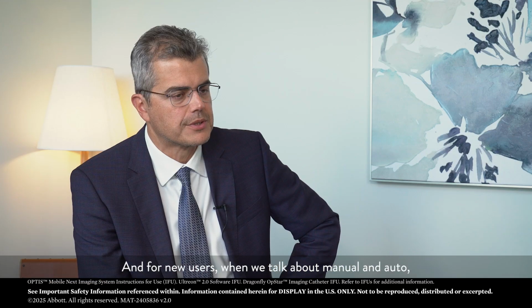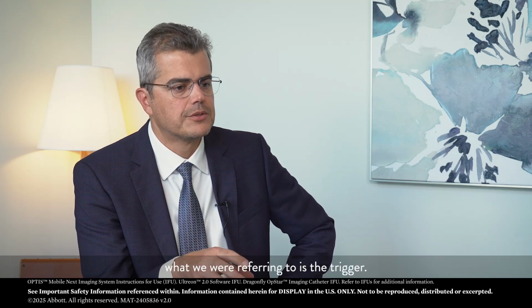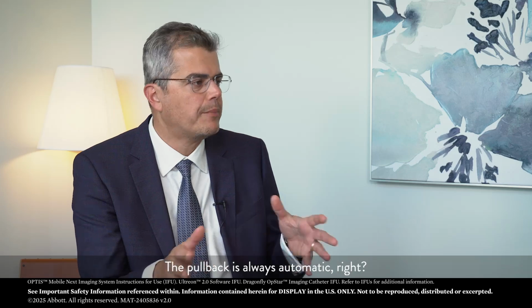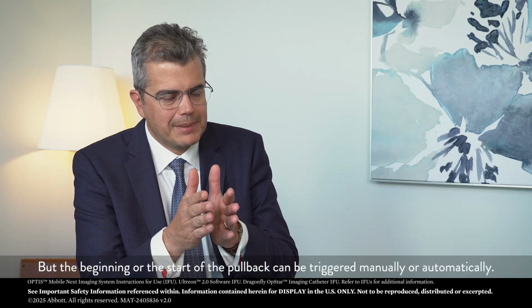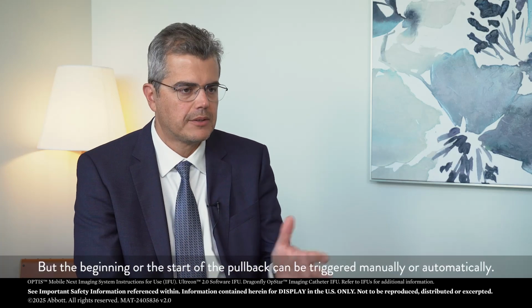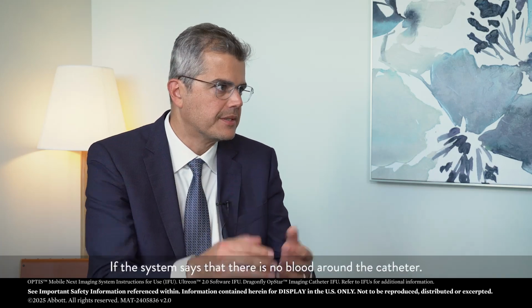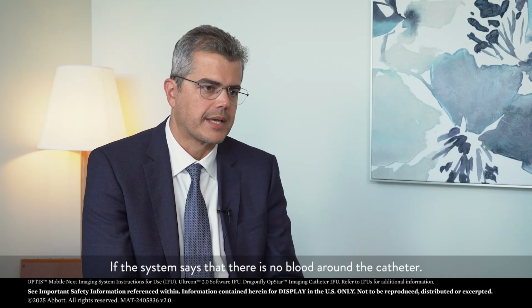And for new users, when we talk about manual and auto, what we're referring to is the trigger. The pullback is always automatic. Right, but the beginning or the start of the pullback can be triggered manually or automatically if the system senses that there is no blood around the catheter.